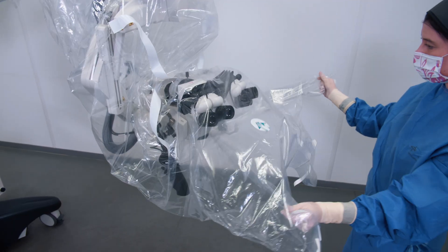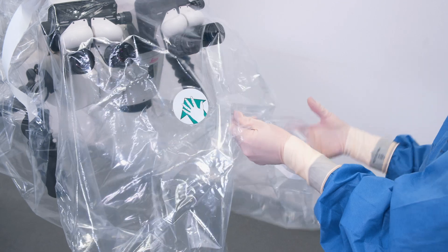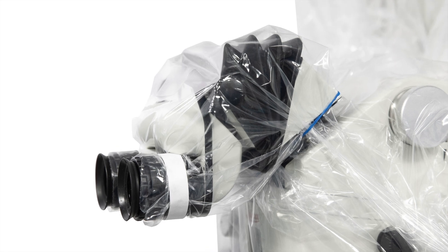It's now time to drape the eyepieces. The drape has several eyepiece covers. Choose the middle one from the three facing you to drape the surgeon's eyepiece. Then use the other ones, depending on the number of eyepieces to be draped.